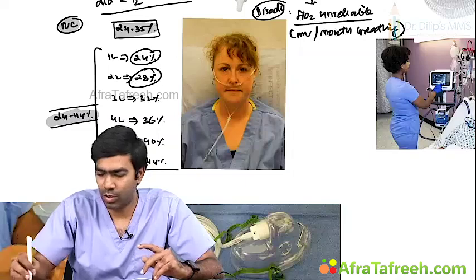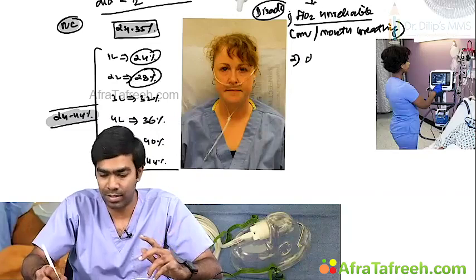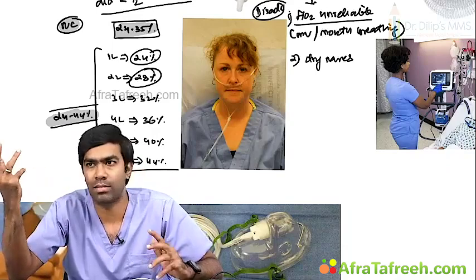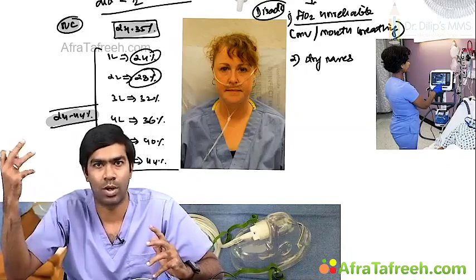So this is all about the simple nasal cannula. It's a low flow device. That's all. The second disadvantage you're going to get is a side effect, that is dryness. You might ask me one question: sir, how is it possible? I am seeing a humidifying jar over there, called a bubble humidifier, isn't it? You would have seen it in the corner.